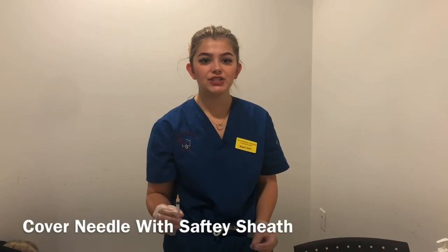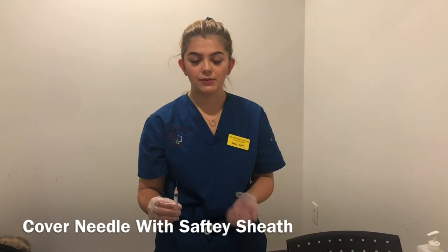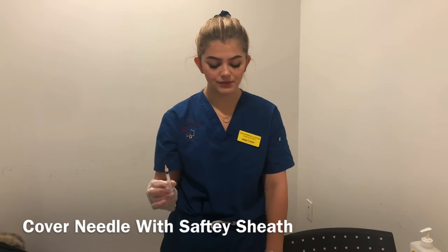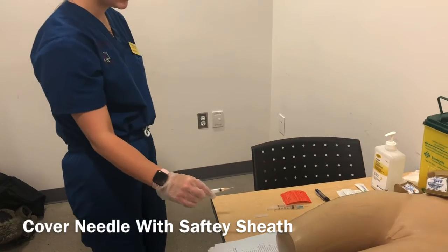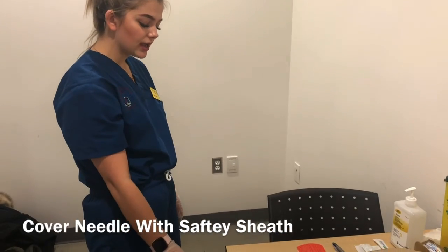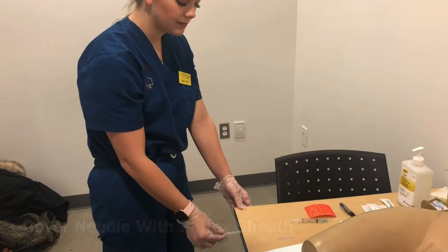Okay, so after administering the medication, if you do not have the protective cap for the sheath, you can recap your medication. So the appropriate technique to recap your medication is to have the top lying on the counter. You want to come with the needle facing away from you and scoop up the needle like this. And you want to get a firm hard surface and just press the needle closed.